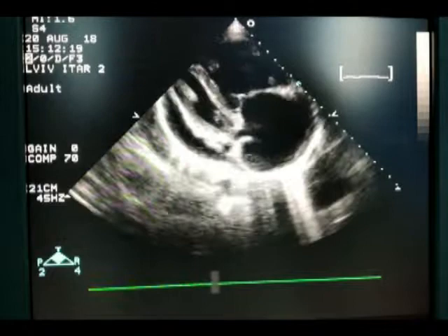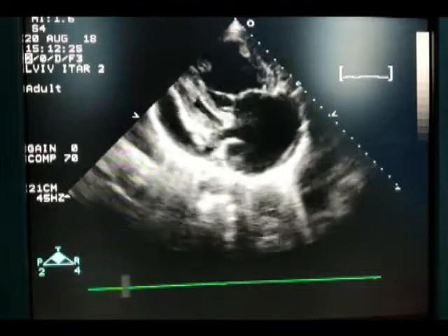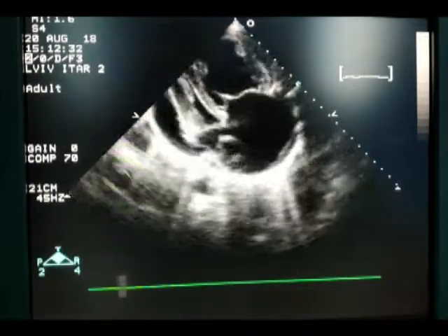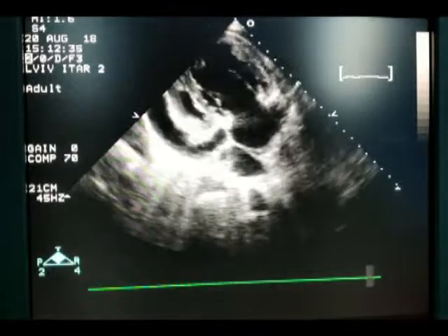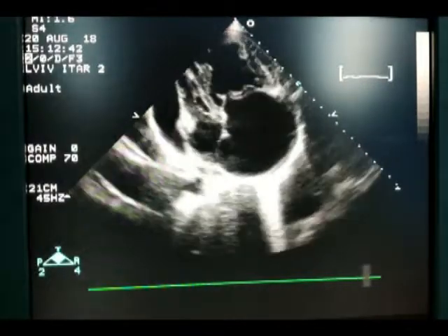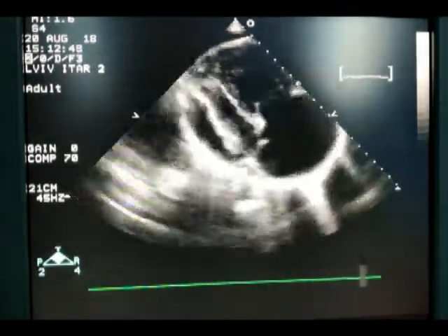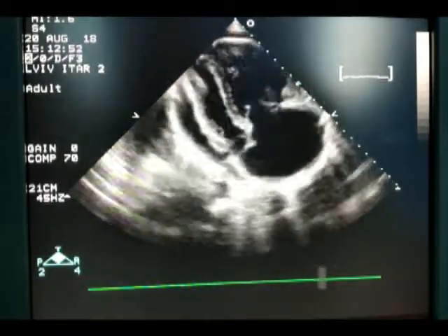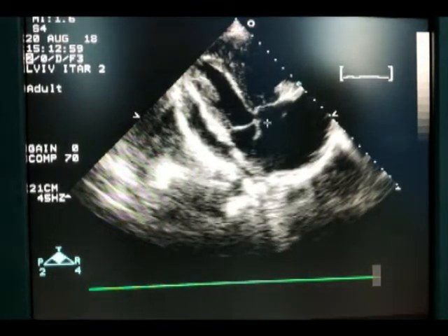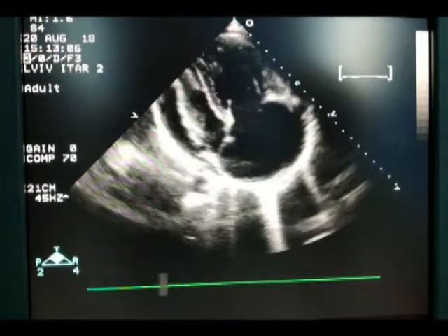If we compare the contractility of the left ventricle and right ventricle, we see that the right ventricular contractility is significantly reduced. According to my eyeball assessment, the right ventricular ejection fraction is not more than 30%. The assessment of right ventricular ejection fraction is more difficult than that of the left ventricle. In the apical four-chamber view, please note how much larger the right chambers are compared to the left. The right ventricle and right atrium are significantly dilated and the interatrial septum is displaced to the left as a result of higher pressure in the right atrium. The movement of the interventricular septum is paradoxical and it participates in right ventricular systole.